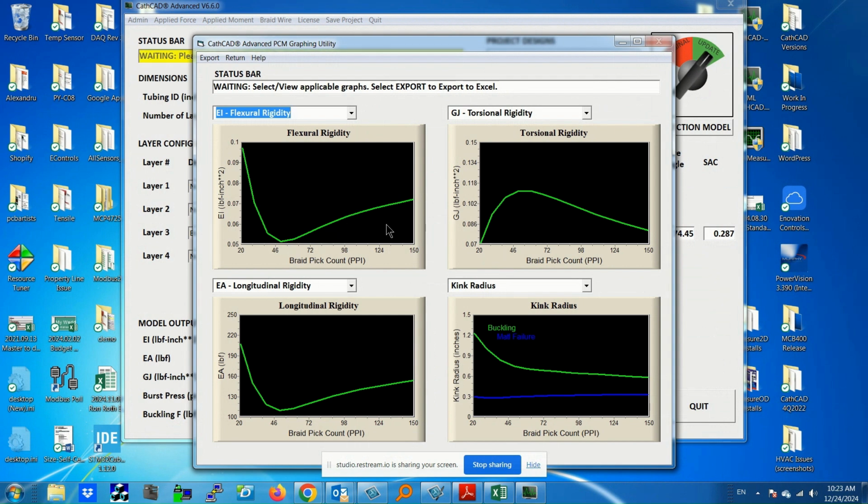Okay. Torsional rigidity, I'm going to comment about that real quick. Typically, your max torque occurs at a braid angle of 45 degrees. And for those of you who have had a mechanics of materials class in college or something like that, you'll hear that the highest torsional strain, shear strain occurs at an angle of 45 degrees. That aligns with what CathCAD tells you. So we have certain indicators when we run models that lend credence that, hey, we're doing the right thing. And that's one of those values.